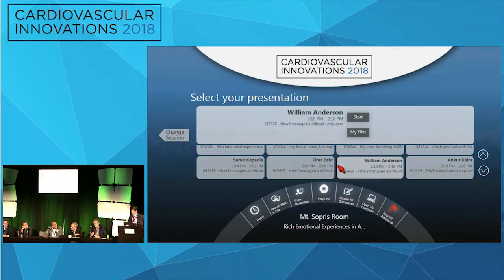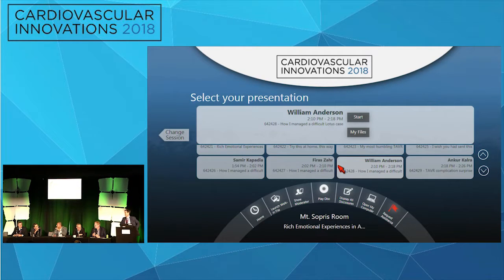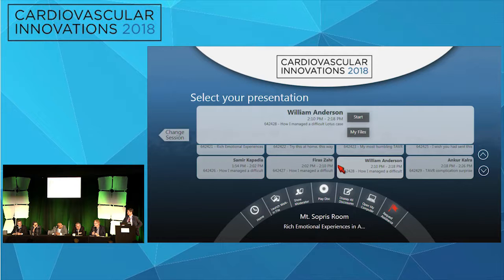But soon enough, you'll be splitting all these, and then... That's right. So my one question was that one important thing to know is that if you don't have sinus flow, so when you look at your coronary angiogram, you don't see any flow in the sinus. If you don't see any flow in the sinus, this is a very high risk for thrombosis. So even though you didn't see thrombus, it's very possible that there was some thrombus in that area because there was no flow in the sinus. If there's no flow in the sinus, this is an important thing because of the very large calcium. Otherwise, you should have some drainage in this sinus.